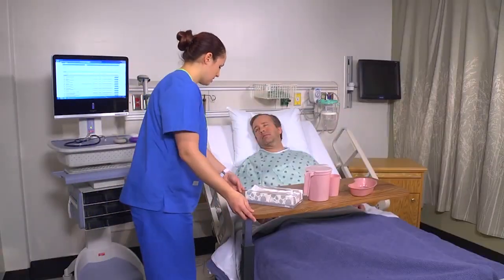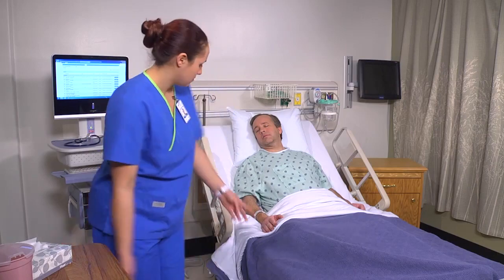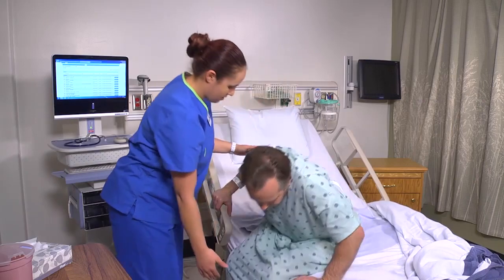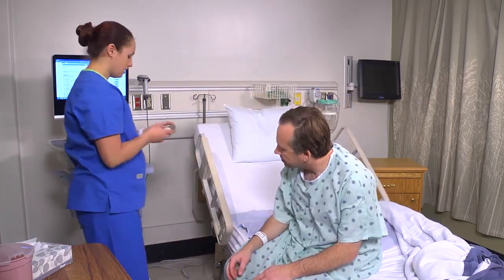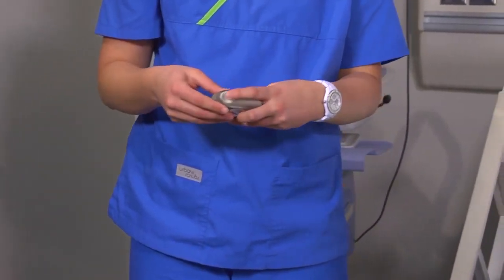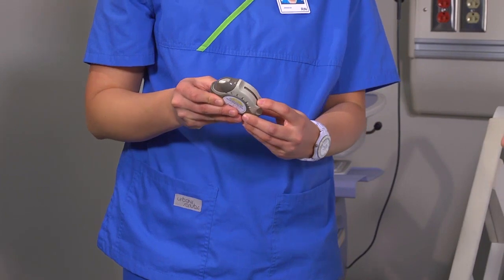Okay, I'm going to help you to the side of the bed here. There you go, all the way, feet on the floor. Good. Caution him not to use the inhaler more often than the healthcare provider has ordered, and advise him to be alert for possible side effects. Then determine his ability to hold, manipulate, and activate the DPI.